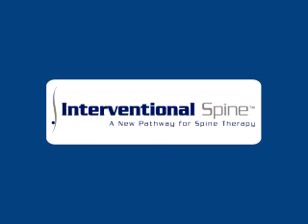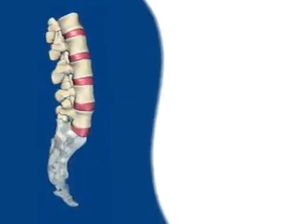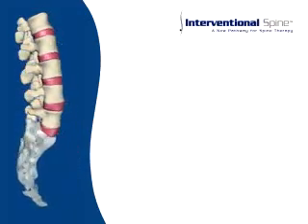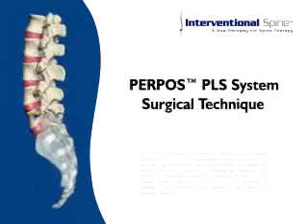Interventional Spine, located in Irvine, California, is a medical device company that designs, develops, and markets percutaneous devices for the spine that provide benefits to patients, surgeons, hospitals, and payers. Today, we are going to demonstrate the posterior lumbar stabilization system, or PLS procedure.